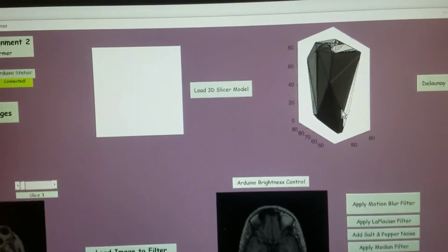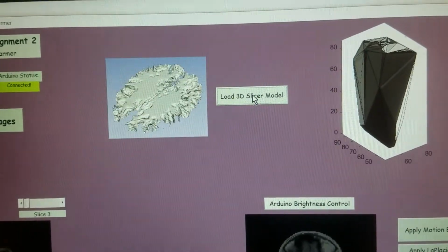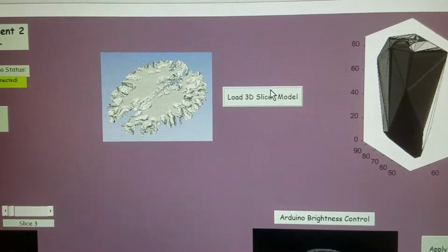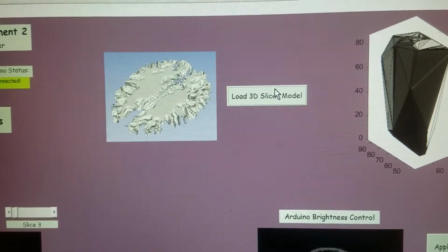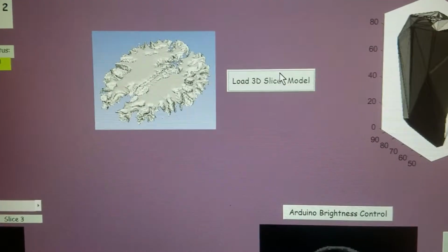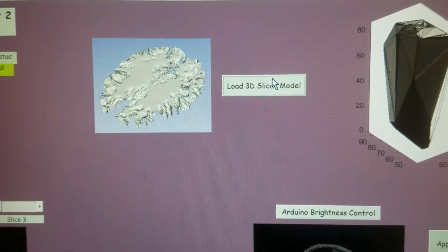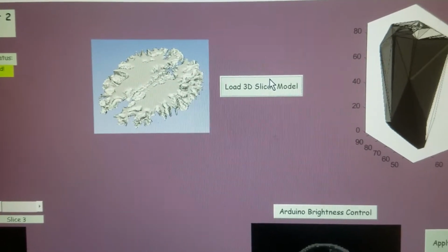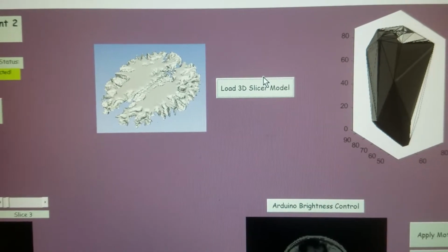And then finally, in all honesty, I couldn't get the .ply file from 3D Slicer to load properly. This is just an image that I got from the application, the function that was offered to some students in the class and shared by the professor. I read online that there's a problem with older versions of MATLAB, that the codes need to be case sensitive, and I couldn't really parse through and figure out why it wouldn't run.